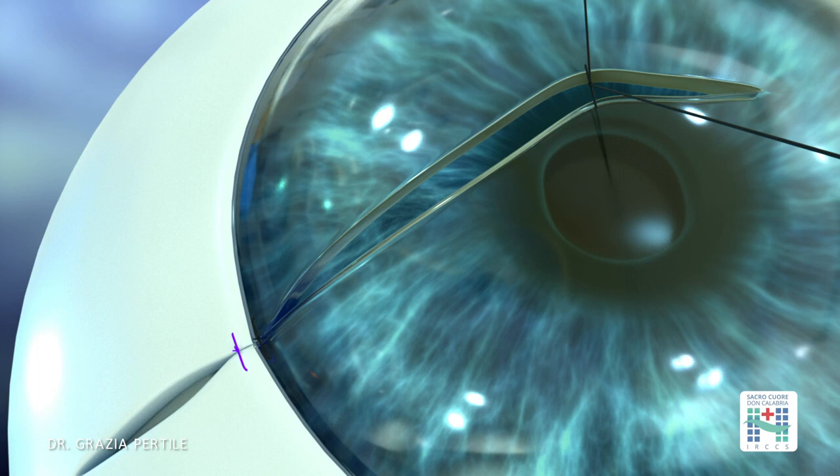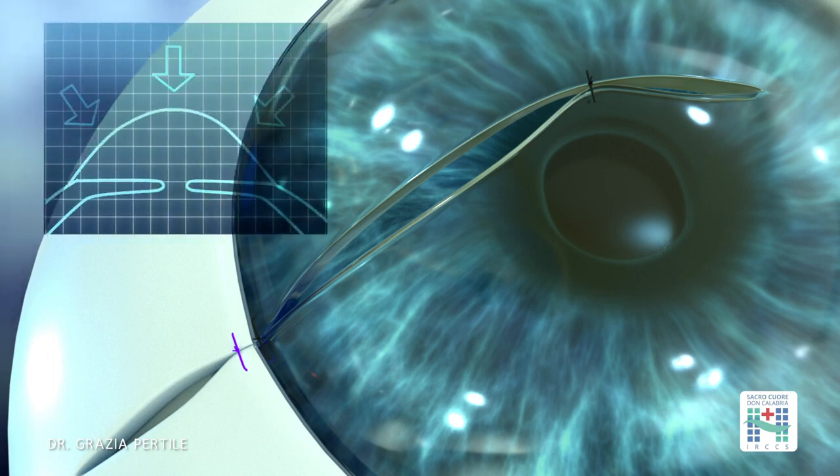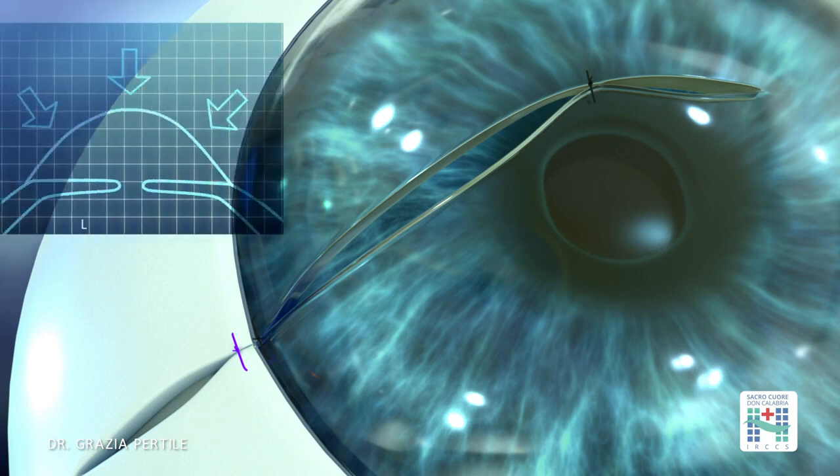Subsequently, the suturing of the cornea is performed. The presence of some irregularities in the wound sometimes allows for finding the correct alignment of the 2 wound edges. Short, almost full-thickness sutures placed at the center of the cornea help restrict the flattening of the cornea and scarring tissue formation. This approach minimizes induced astigmatism and reduces the surface area that loses transparency.